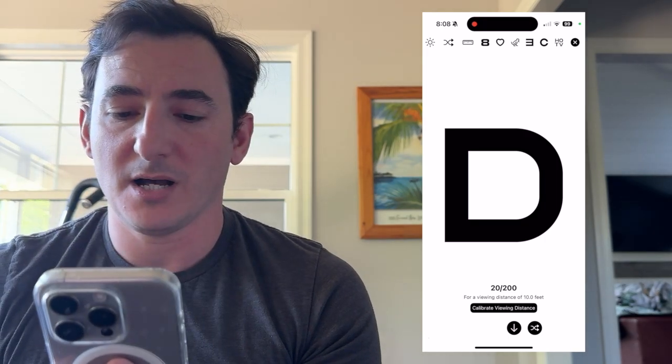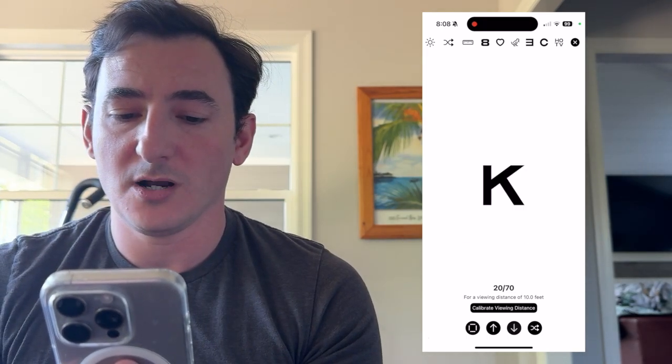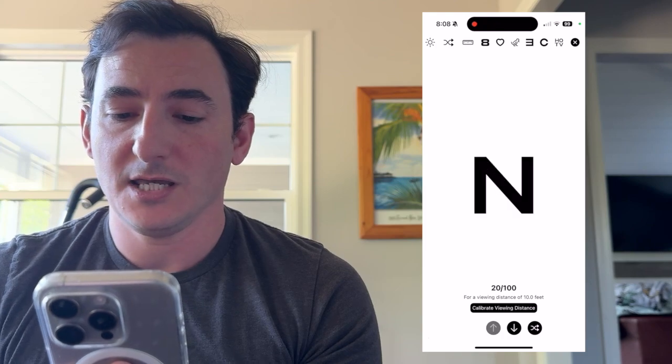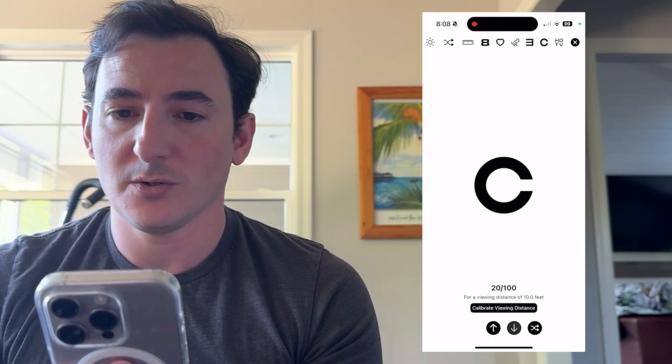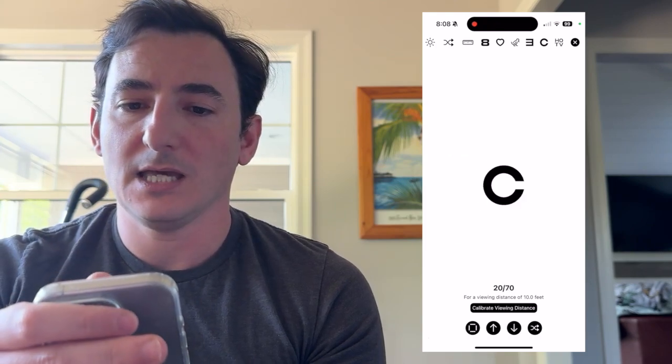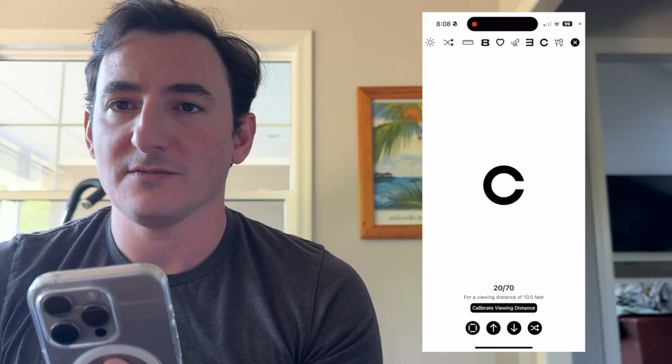There are buttons on the bottom where you can go down a row or up a row, you can shuffle the optotype that you're showing, and you can also change the optotype mode on the navigation bar.